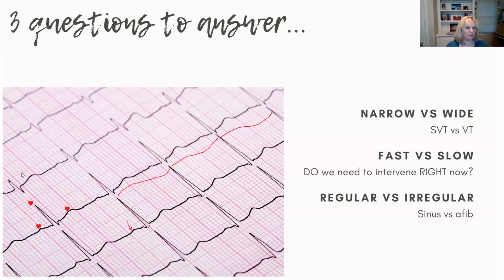So there's a lot of information, even on this just decoration picture EKG, to look at, right? And as KJ said, sinus makes P. Exactly. Hi, Matt. Nice of you to join us. It's always good to see you again.